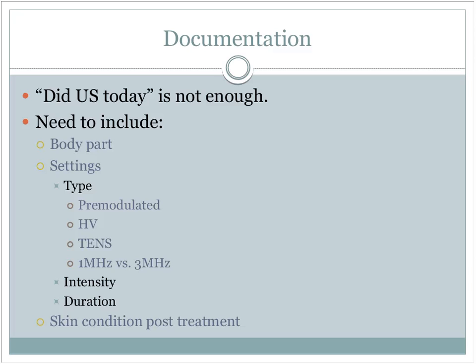It should, okay? So you want to be able to say, when this patient left the clinic, there was no erythema present, because they could bump up against something on the way home, get a small skin burn, and the only thing they remember was that you did eStim, and then suddenly you're looking at a lawsuit. But they pull your documentation, skin check showed no erythema post-treatment, and you're covered.